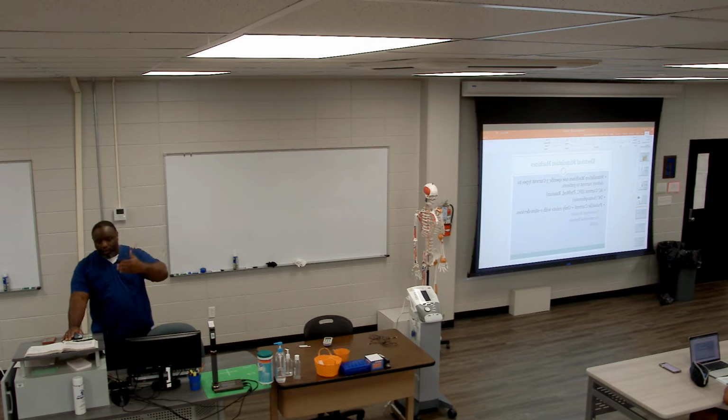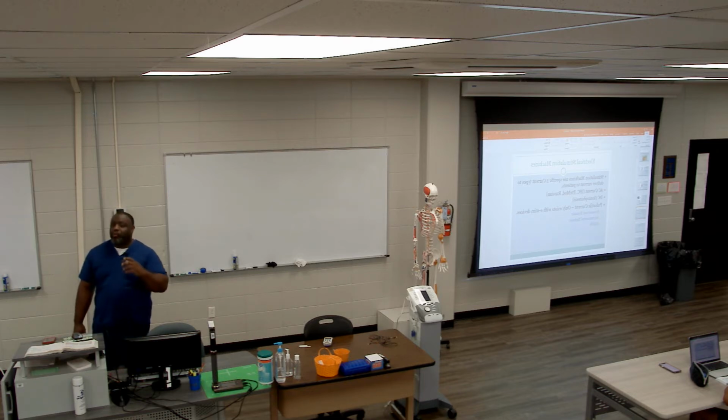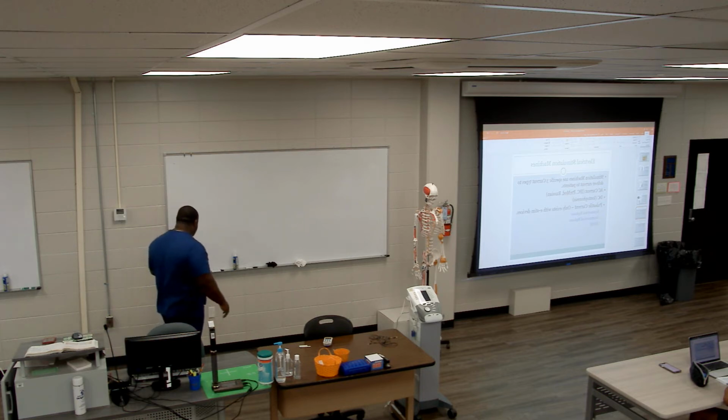So the current is what's being supplied to the device, and what leaves the device is a waveform. Let me clear that up.